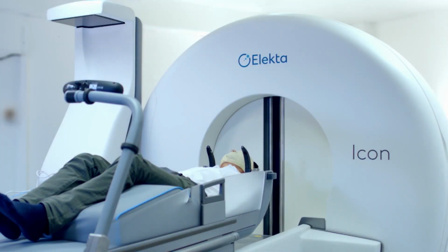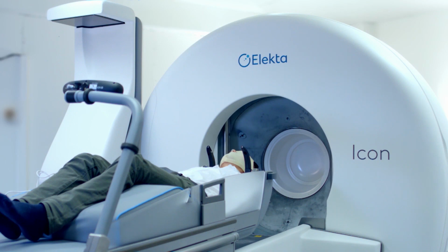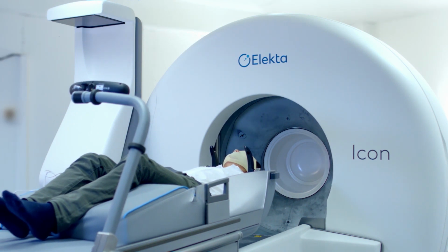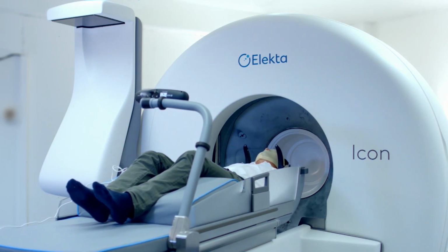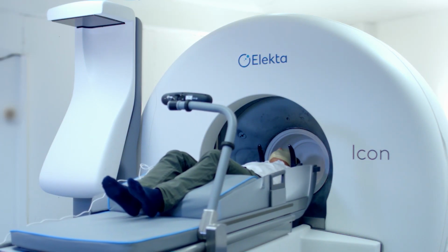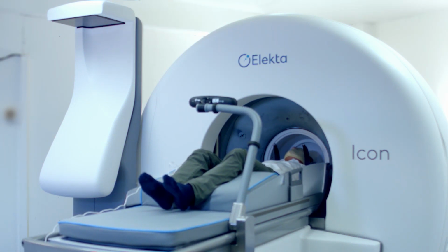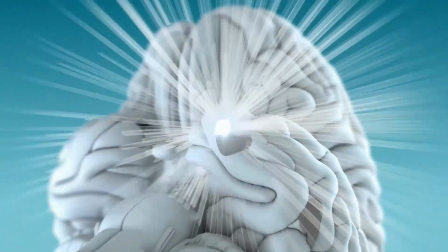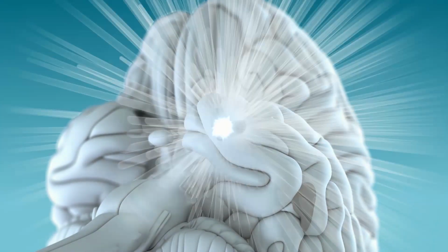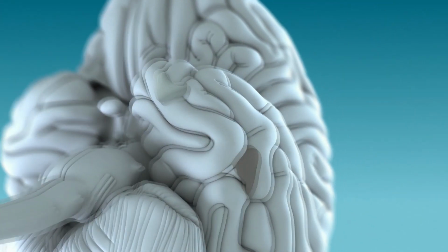And we have found that these lesions, especially those in close proximity to critical structures, are able to be more safely treated with a fractionated approach as opposed to a much more protracted course of treatment that we would treat with on a standard accelerator. We can get patients' treatments done within 3 to 5 fractions of radiotherapy, as opposed to the alternative of having them treated on a standard linear accelerator where their course of treatment may be 5.5 to 6 weeks.